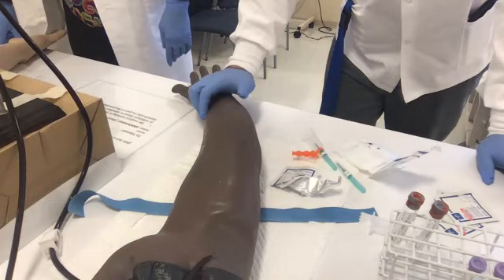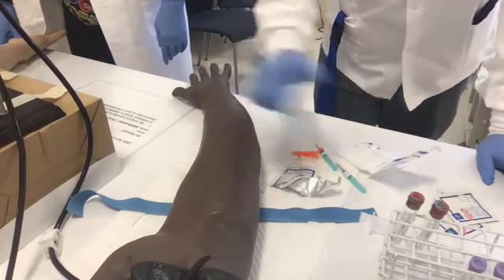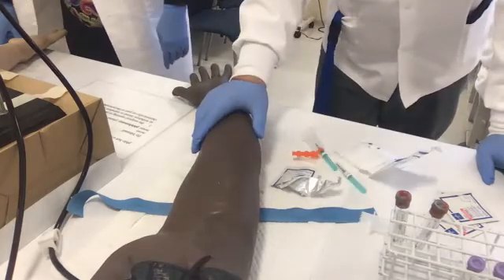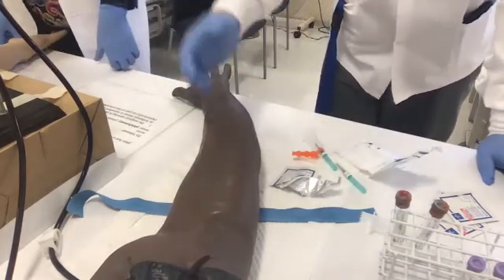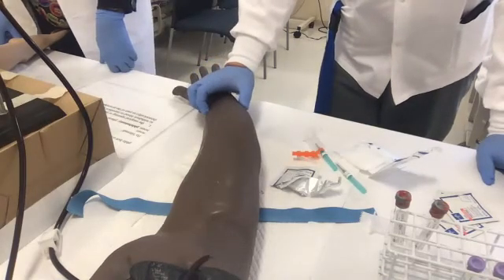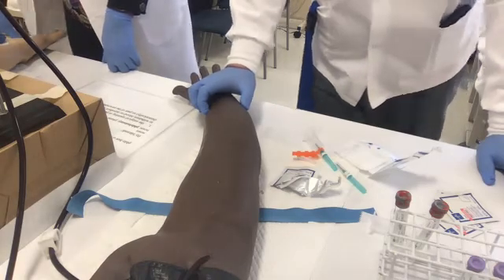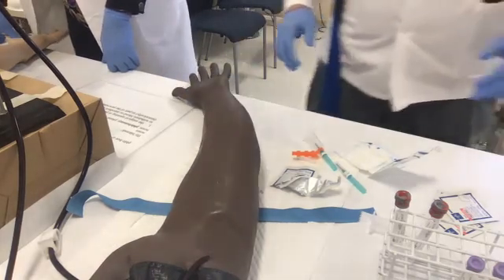Let's give you another doctor, a nice one. Dr. Duranlis wants me to take some blood from you, and I got to take it in these tubes. Is that okay? And then he rolled up his sleeve and he nodded his head. So now I have consent. Mr. Brown goes, I need to confirm your date of birth and the last 4 digits of your social. Okay, wonderful. That's great. So I check on the chart.